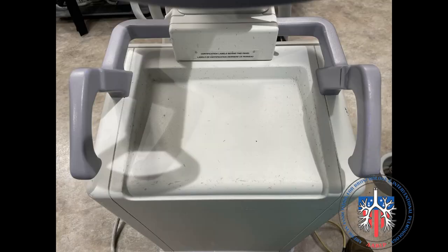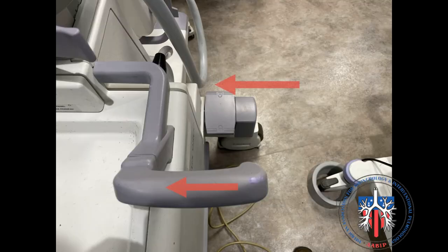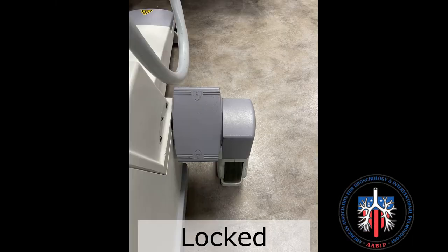Moving the C-Arm is done by turning the handles shown here. In this orientation, the C-Arm is unlocked and it can be moved forwards and backwards. Here the handle is rotated and the wheel turns — the C-Arm can now be moved left or right. To lock the C-Arm in position and keep it from moving, press this foot pedal. It is now locked.